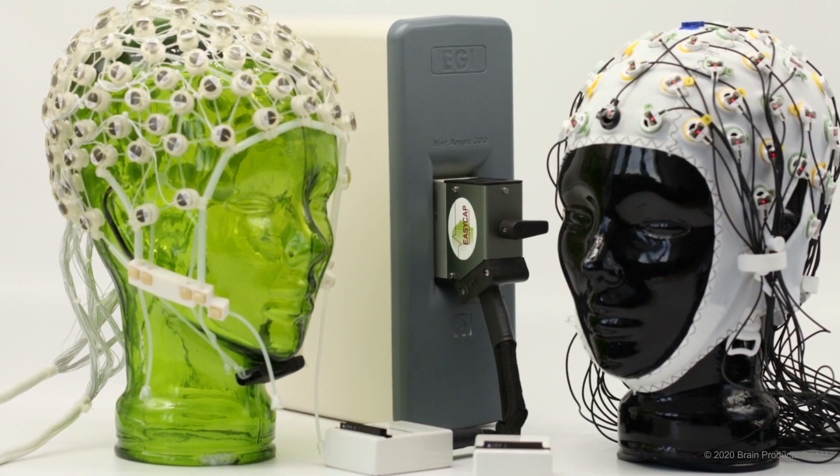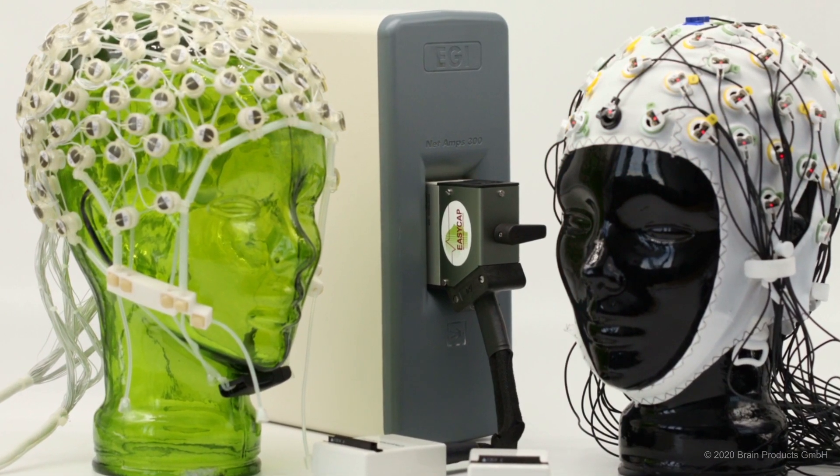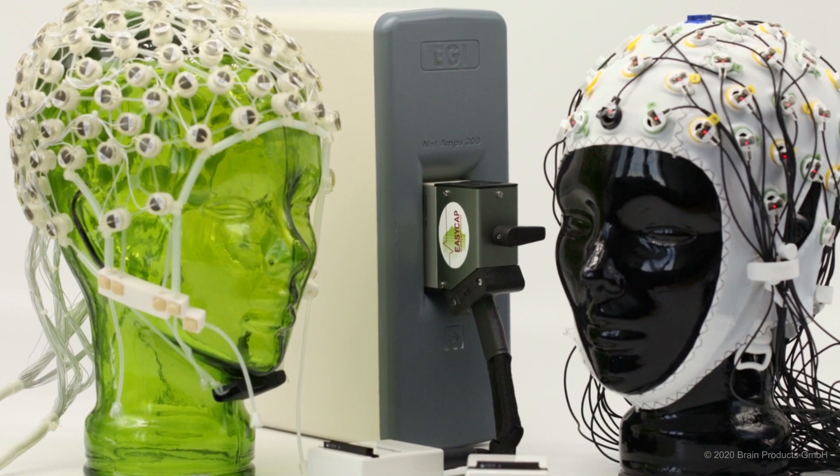Either way, we can give you the opportunity to use both in combination with your current Net Amp amplifier. You simply need to connect the parts and you are set and ready for recording.